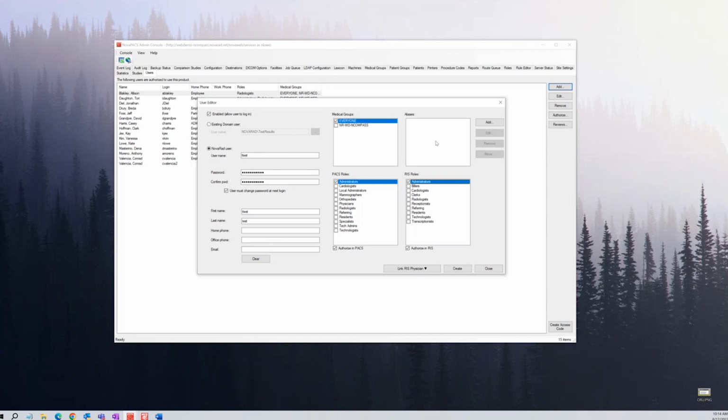What I mean by that is, let's say I'm a referring physician, ordering entity A will send my name across as Nate space Low, right? Ordering entity B may send it across as Low comma space Nate. And there are many different ways to send across a name. And the alias is to catch that.